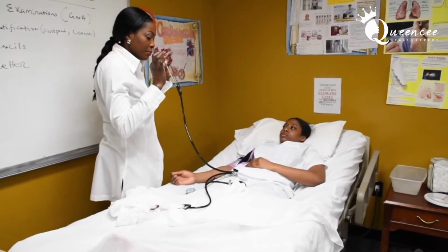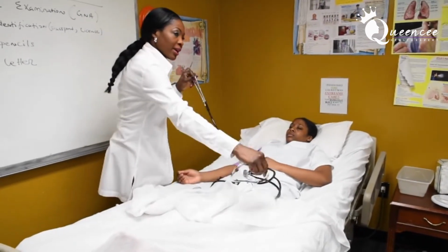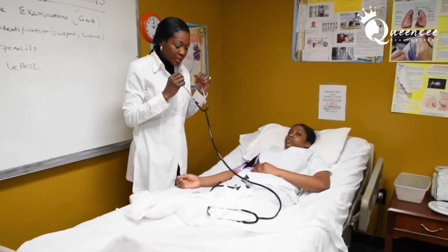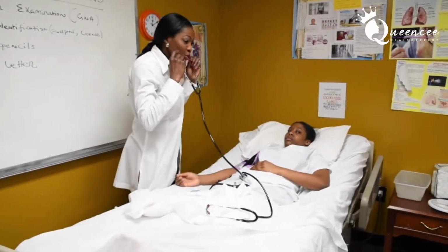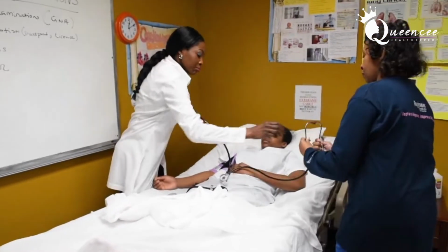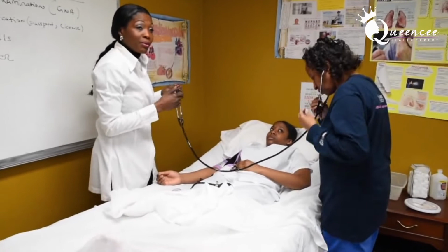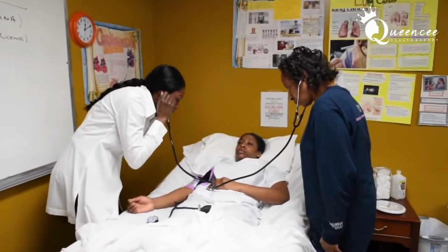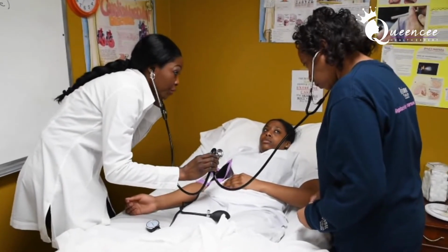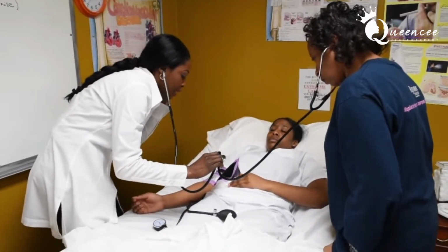Take my earpiece, hand this to the examiner. Can I do it with you, please? I just want you to get a full picture of how this is going to look. Like, this is my examiner, that's how it's going to look, okay? You do this. They are just here to listen with you. They're not doing any of the steps, okay?